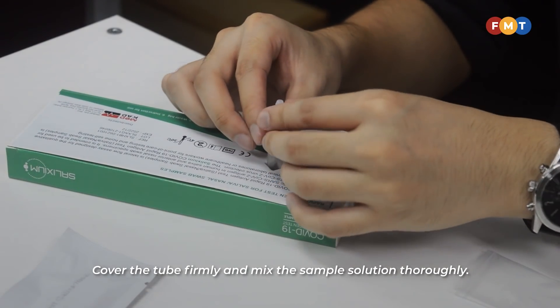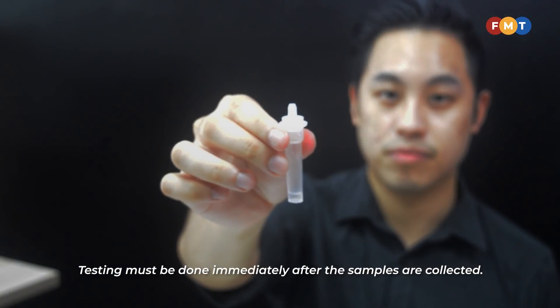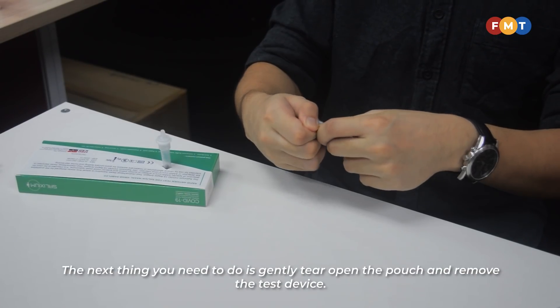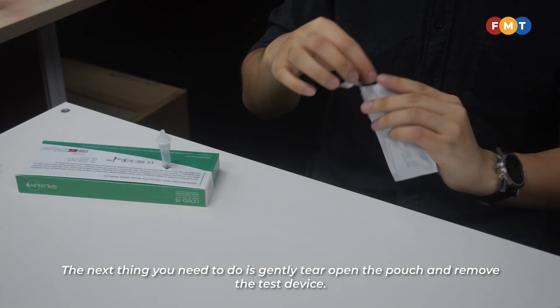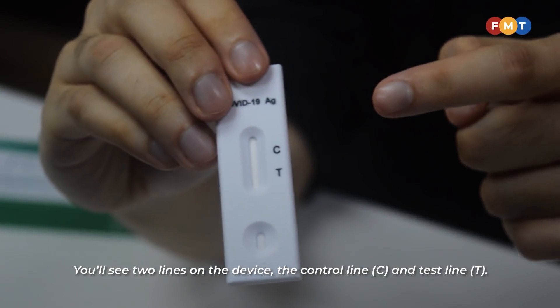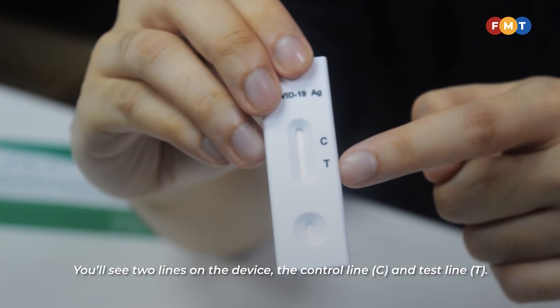Cover the tube firmly and mix the sample solution thoroughly. Testing must be done immediately after the samples are collected. Next, gently tear open the pouch and remove the test device. You will see two lines on the device: the control line, C, and the test line, T.